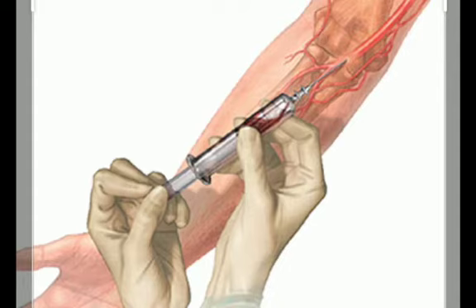While generally safe, the procedure can be upsetting and painful for the patient. There are also several potential contraindications that can affect the site of collection, such as infection. There is also an increased risk of bleeding complications in patients with coagulopathy. Therefore, as we said before, the most common way of sampling is venipuncture.